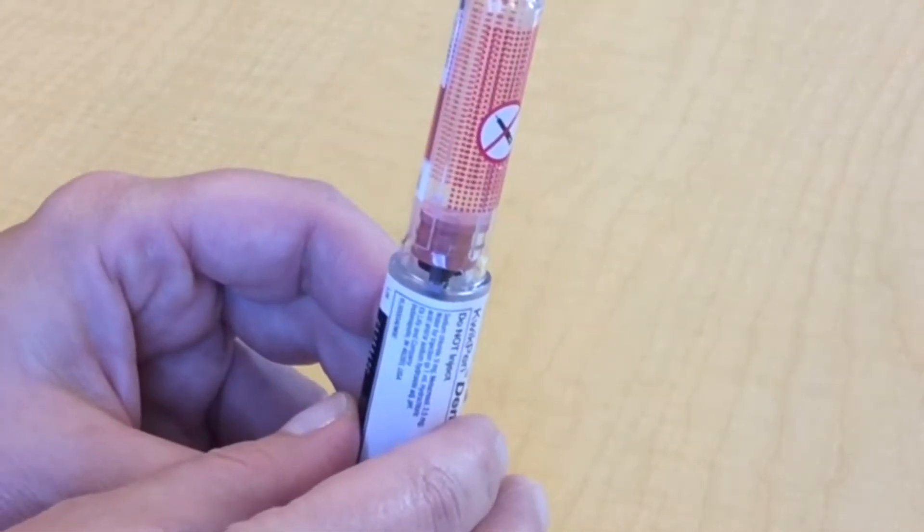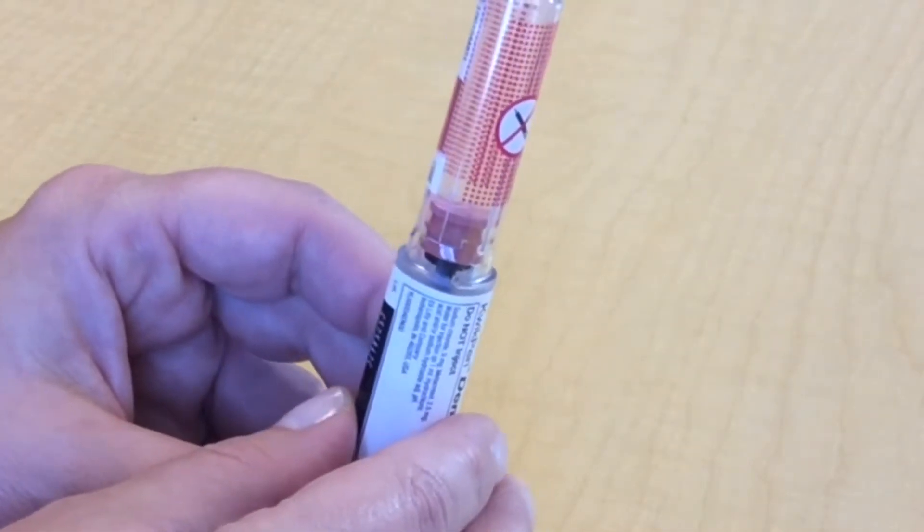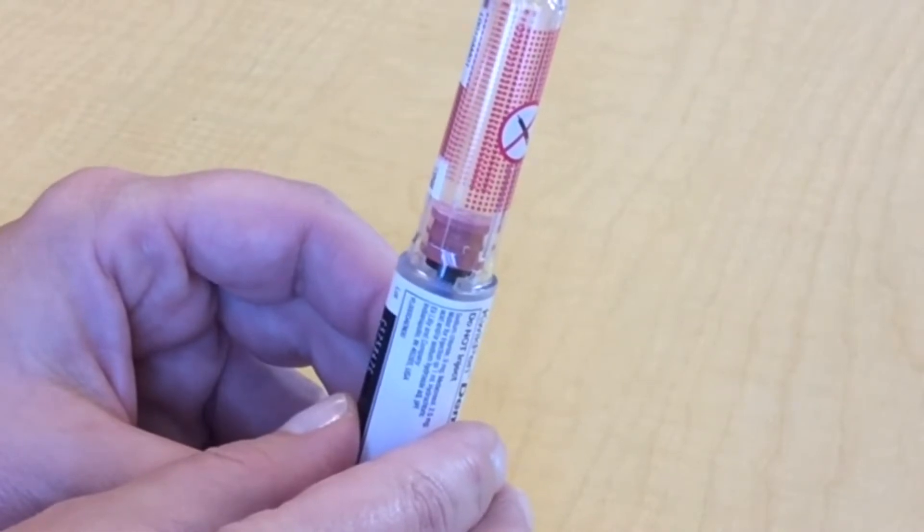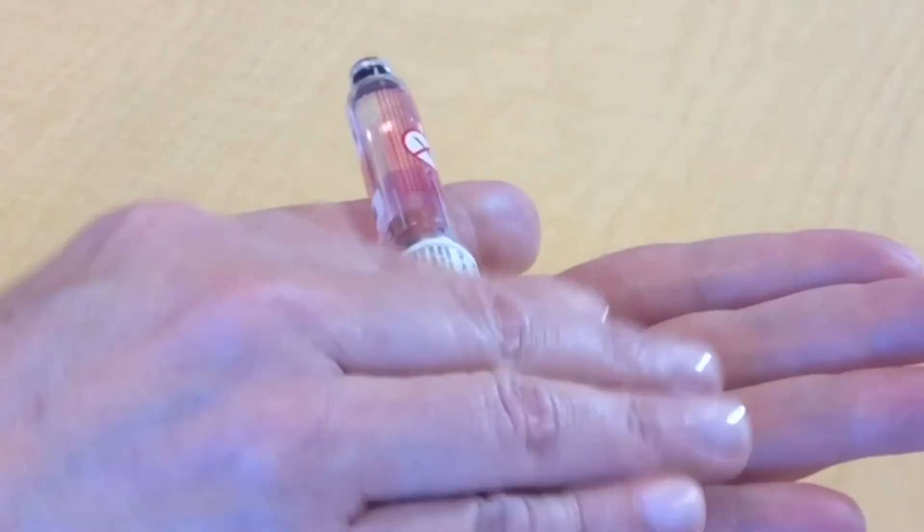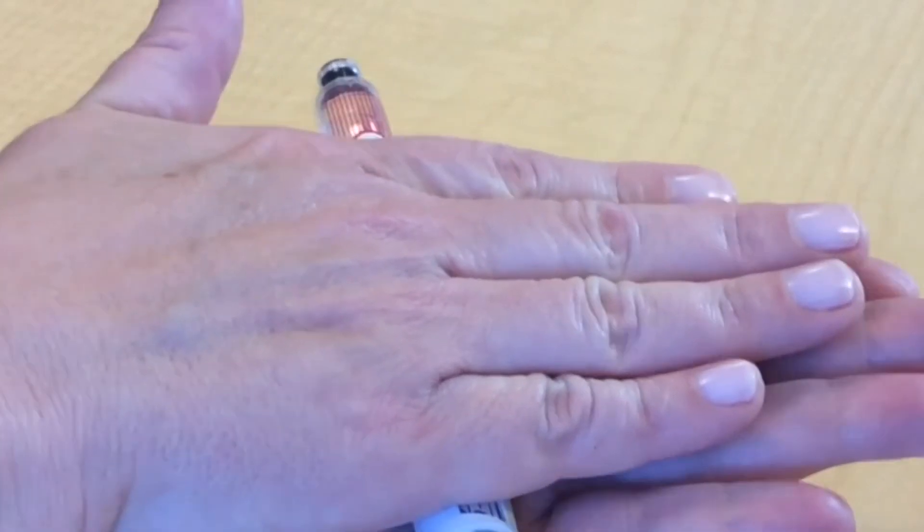If your insulin is cloudy, this means it will need to be mixed before you use it. To mix your insulin, place the pen between your palms and roll it 10 times.